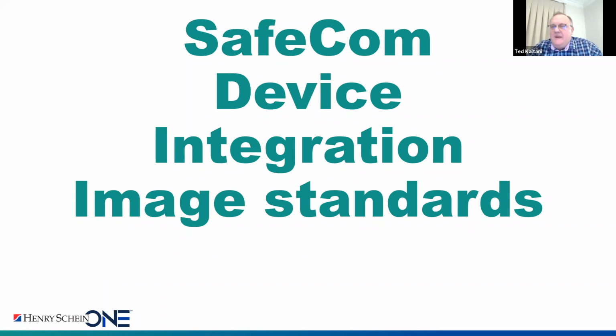So these standards have been existent for a long time. Are they used in dental much? No, they're not. And the reason is because every manufacturer builds that Twain interface differently. They haven't focused on that. They've been focusing on the proprietary interfaces. Not for a bad reason. It's just that sometimes it takes a bit of time until things change. So we have a standardized interface for all of them.